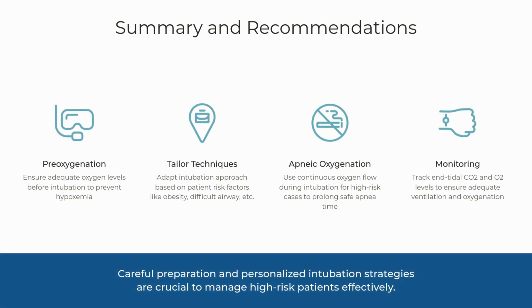Summary and recommendations. To wrap up, preoxygenation is a must for every patient undergoing intubation to maximize oxygen reserves and prevent hypoxemia. The technique should be tailored to the patient. Routine face mask for low-risk cases, positive pressure for reduced FRC, and combined approaches for difficult airways or critical illness.